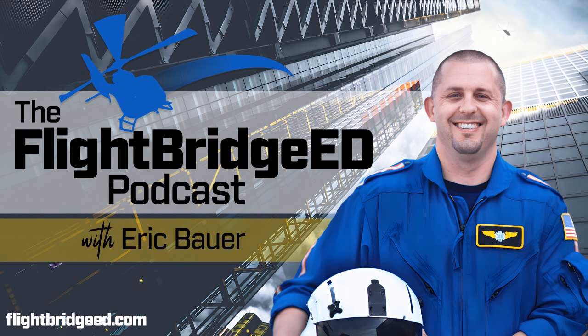Again, respiratory rate is your protection. We want low respiratory rates. A higher respiratory rate, as in the injury approach, is not going to allow them time to blow off that CO2. As far as PEEP in these patients, they don't need PEEP. Remember, we want to check their auto PEEP. We want to make sure that they're not already overextending their alveoli, and adding more PEEP onto that is going to be bad for them. We don't want that. So you can turn the PEEP all the way off in these patients, or you can have it at 2 to 3.